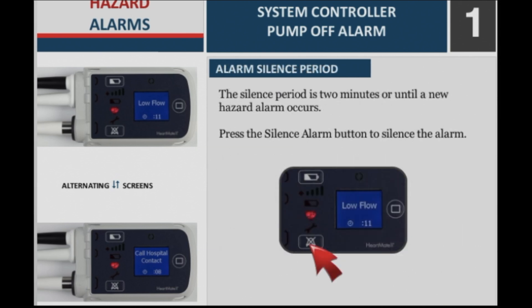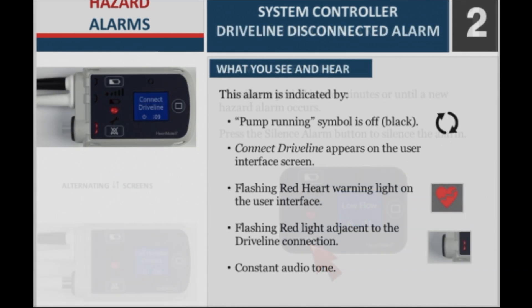Alarm silence period: The silence period is 2 minutes or until a new hazard alarm occurs. Press the silence alarm button to silence the alarm.